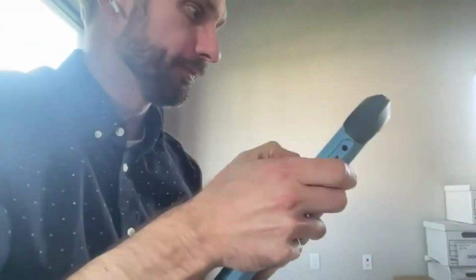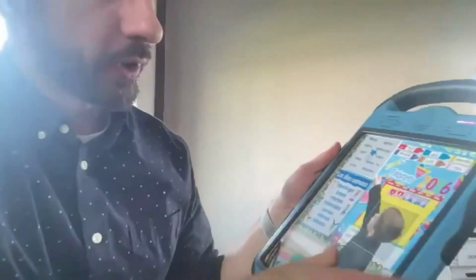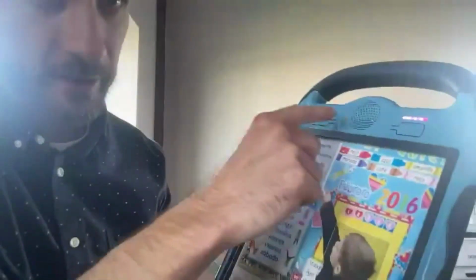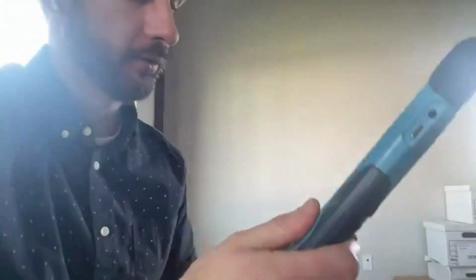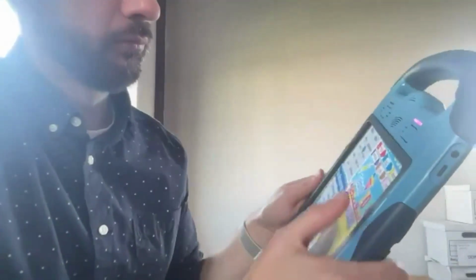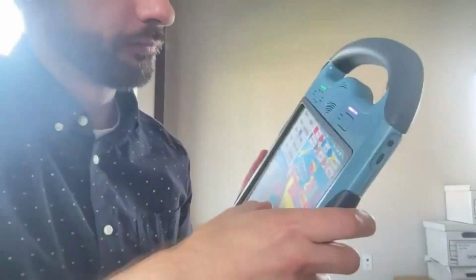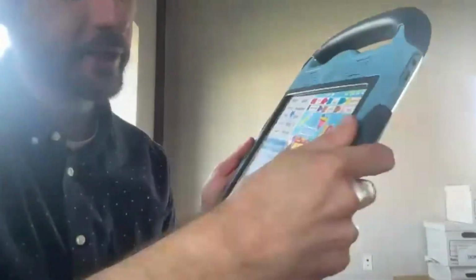These are the colors. And then to record, I tap where I drew a hotspot, speak into the microphones up here, and then tap again, and that stops the recording. Jonah is practicing Spanish. I hit the record button on the back to go back to the standard mode.